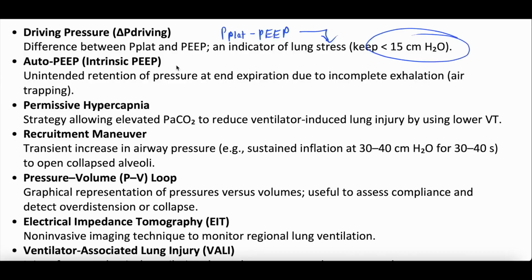Auto PEEP or intrinsic PEEP or breath stacking are all concepts that describe or give a name to the retention of air at the end of expiration. Again, this is an easy topic that sounds confusing when you just hear it for the first time, but when a patient breathes in, if they breathe in 500 cc's of tidal volume, but for whatever reason, they're only able to expire 450 cc's before the ventilator gives them the next breath. That means there's 50 cc's left in their lungs.